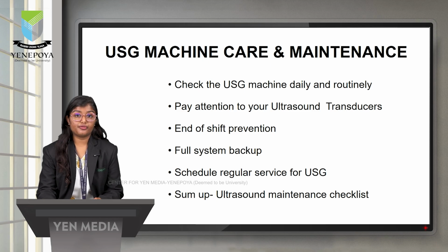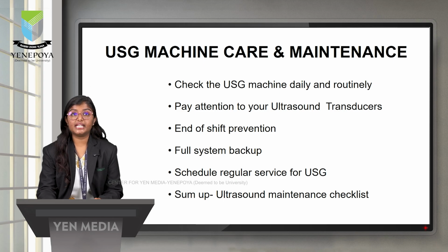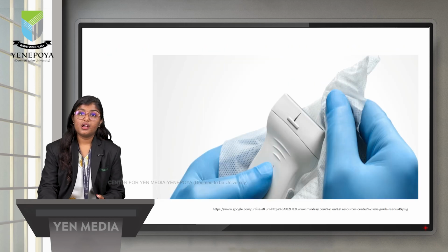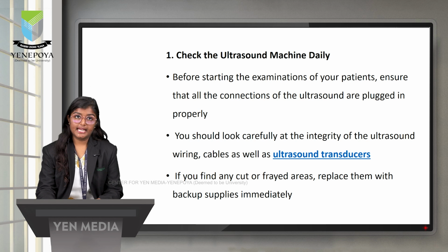starting with checking the USG machine daily and routinely. Pay attention to your ultrasound transducers, end of shift prevention, full system backup, schedule regular service for USG, and sum up with an ultrasound maintenance checklist. Start with the first step, check the ultrasound machine daily.